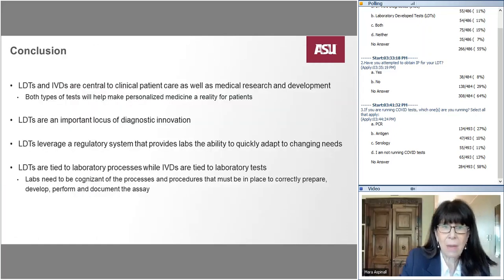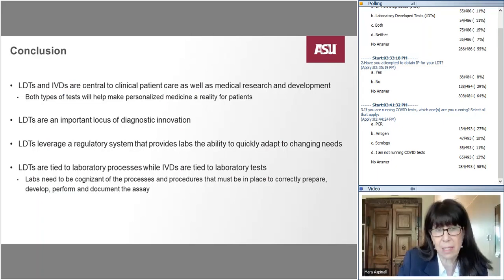So with that, I want to get to my conclusion, and I think we have a couple of minutes to take some questions. LDTs and IVDs are central to clinical patient care as well as research. Both types of tests help with personalized medicine. LDTs are critical for diagnostic innovation. They leverage a different regulatory system that allows the labs to adapt quickly. And LDTs are tied to laboratory processes where IVDs are tied to laboratory tests.